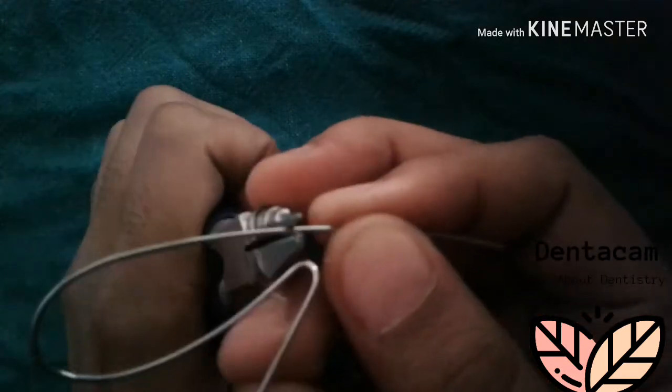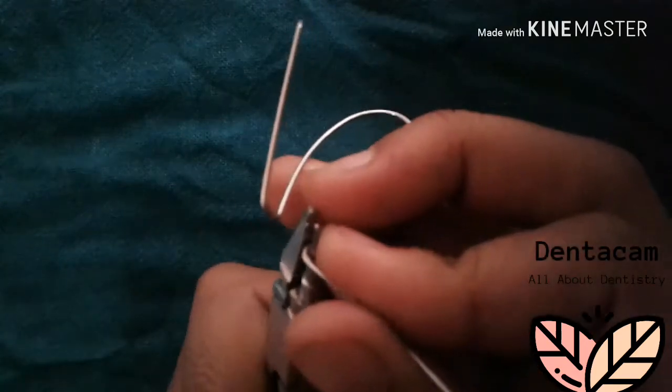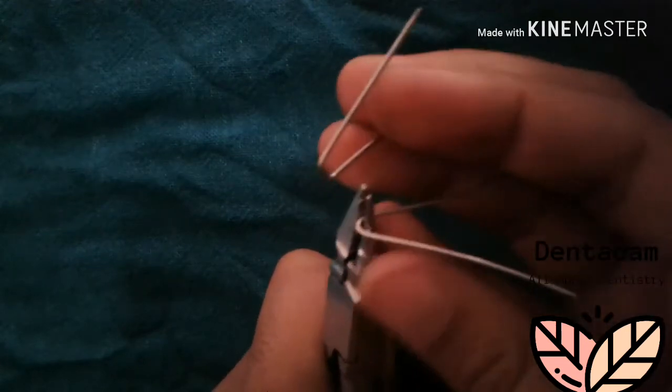Do the same on the other side. This angulation makes for easy adaptation of the coffin spring.